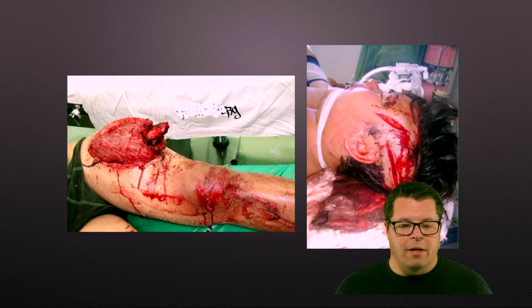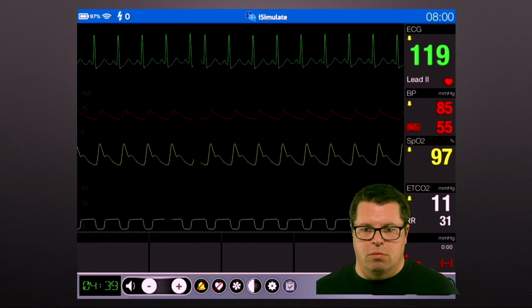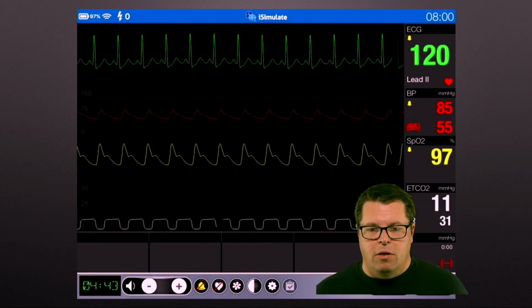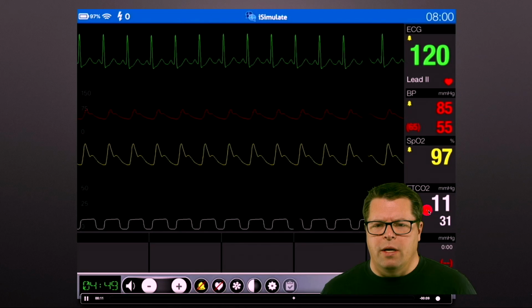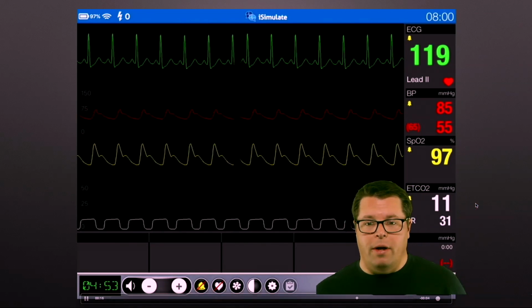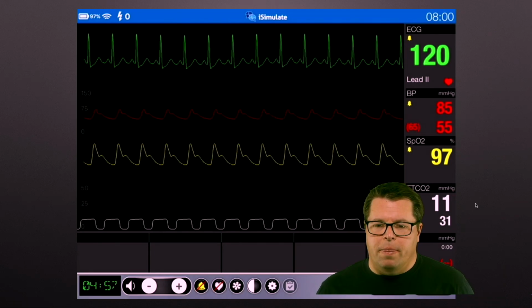We snake a tube down his trachea, and we put end tidal CO2 on the end of it, and we get something that looks like this, pretty similar to the other guys here. Now, when I look at that, you may remember me saying that a normal end tidal CO2 that we typically aim for is somewhere between 35 and 45. Or on the low end, even mild hyperventilation should give you 30 to 35, thereabouts. And that's kind of the goal.